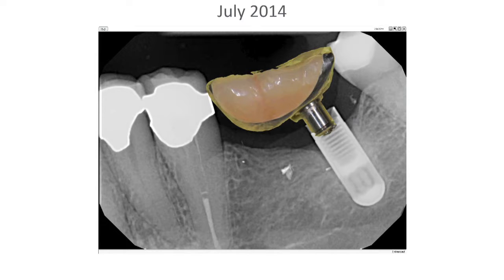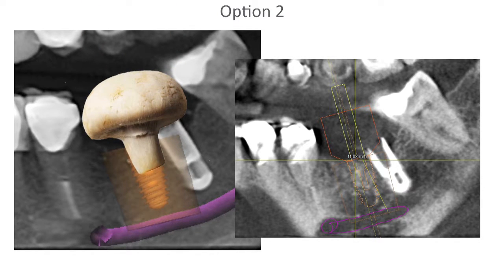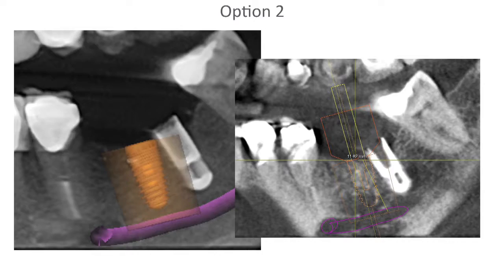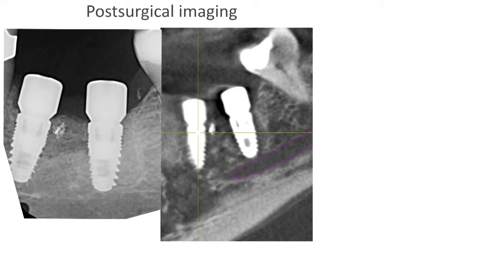It came in. One of the concerns we had is, what do we do? Rather than have this off-angled cantilever type of can we do a single implant right here? What's it going to look like? Well, here we're going to look like a gigantic mushroom in the middle of this space that he has there. It's so big. Or we chose instead to do two implants, two smaller implants. And in doing so, we found something along with the bone.